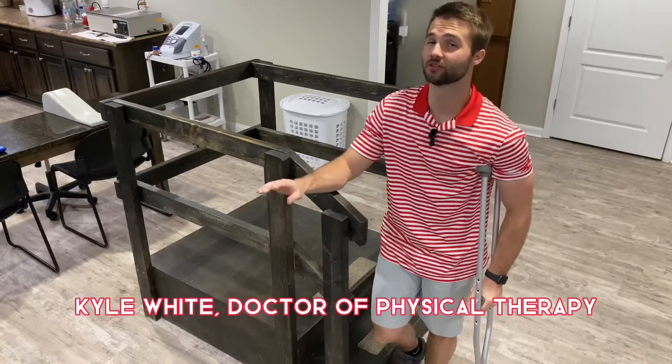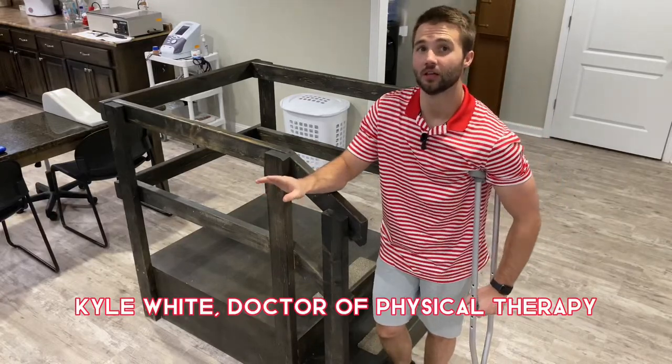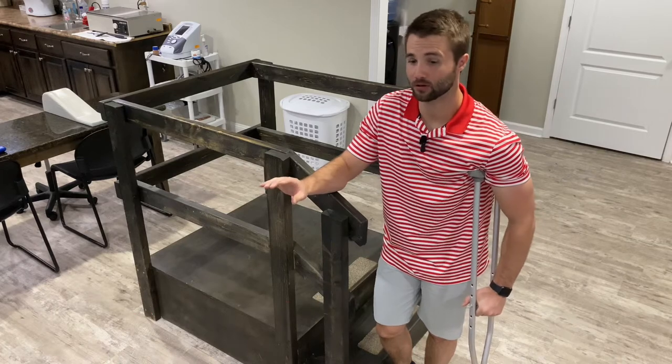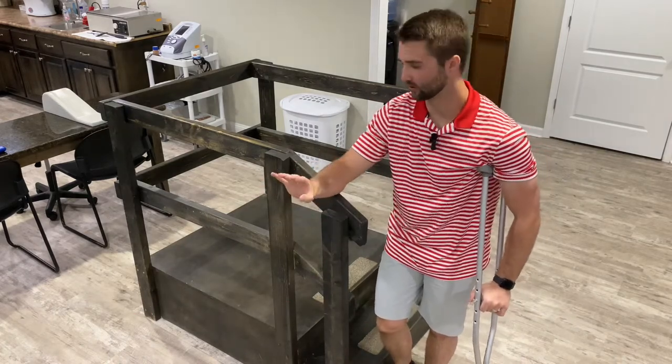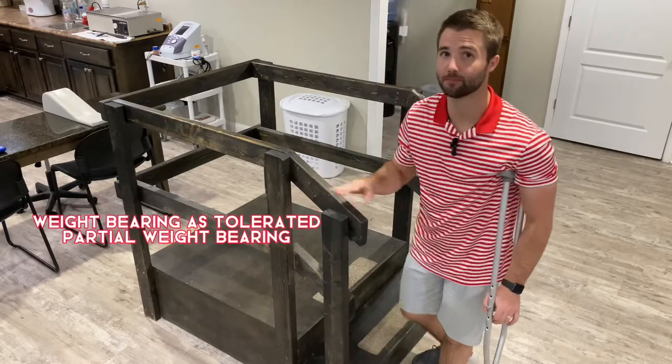Going up and down stairs on crutches can be a little scary, especially if we just have one crutch. If we're on one crutch, we're going to be weight bearing as tolerated or partial weight bearing, so we can put the bad side down.